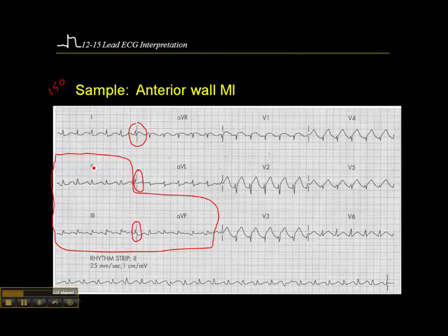If we look at leads 2, 3, and AVF — I don't see any ST elevation in lead 2. Lead 3, it's kind of difficult to say. I don't see any ST elevation in AVF, so we can rule out an inferior wall MI.